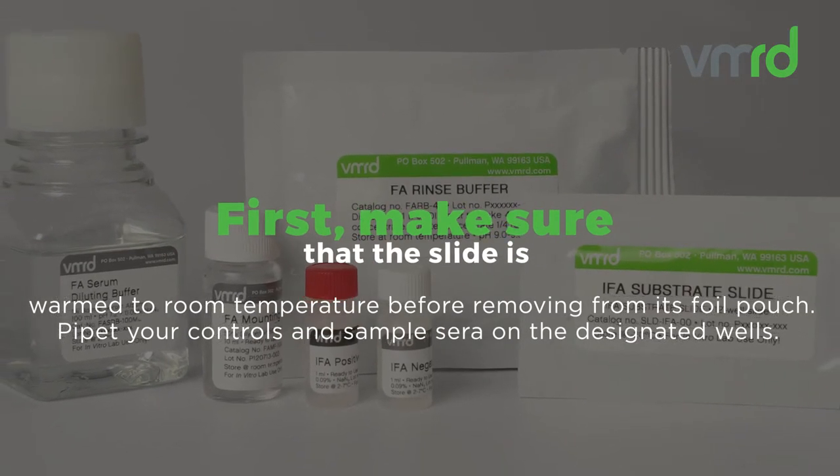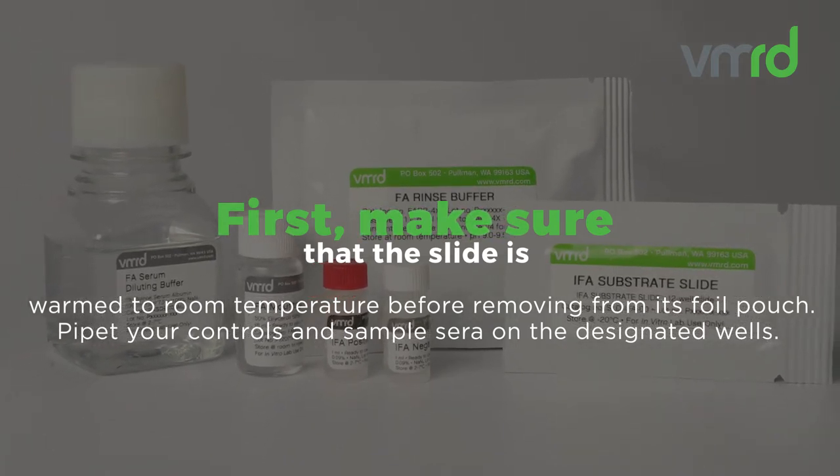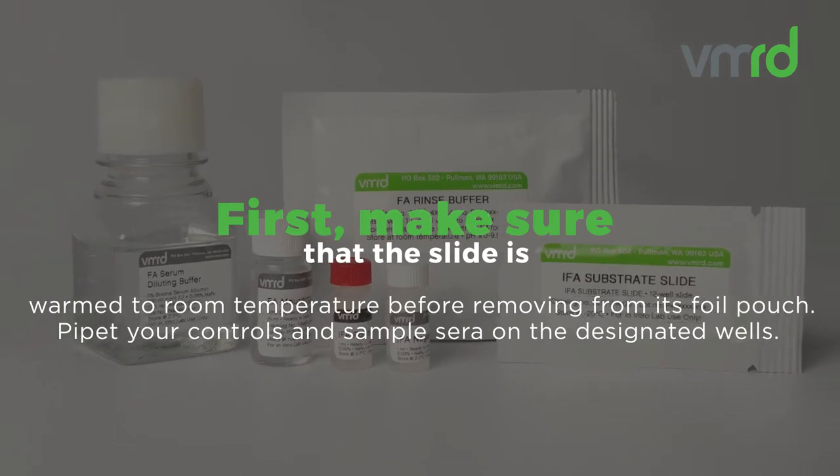First, make sure that the slide is warmed to room temperature before removing from its foil pouch. Pipette your controls and sample sera on the designated wells.